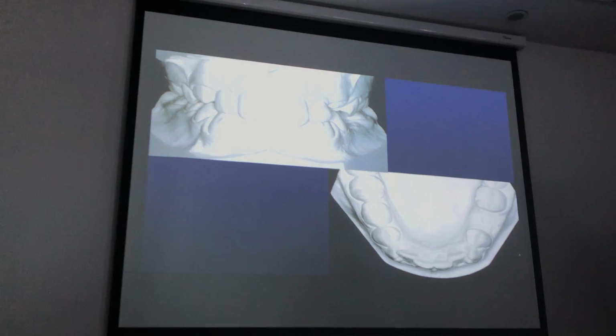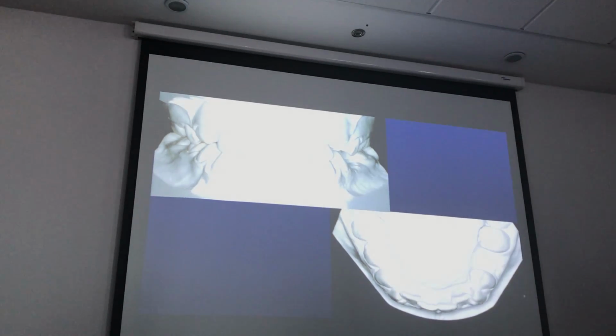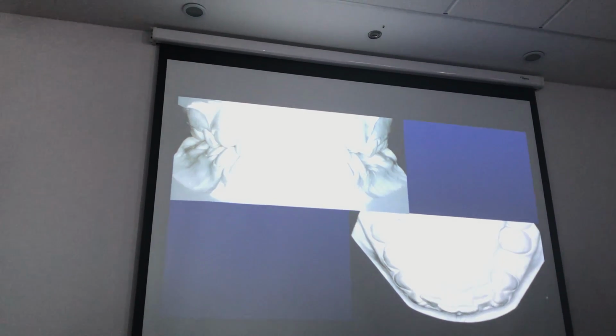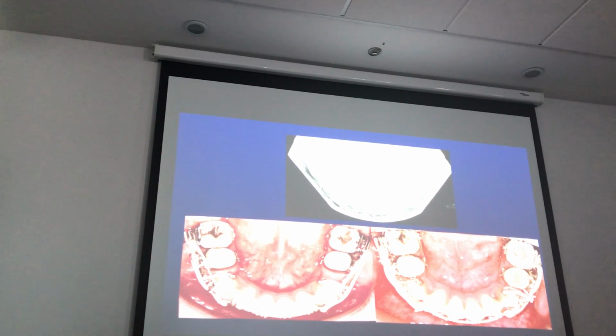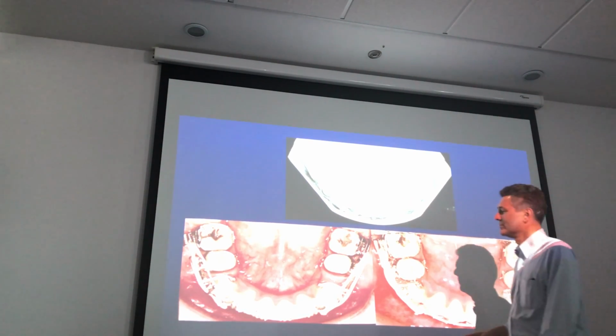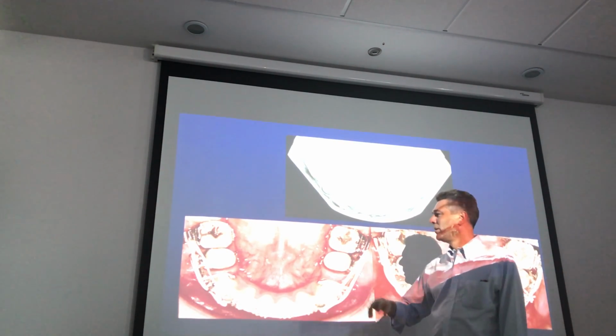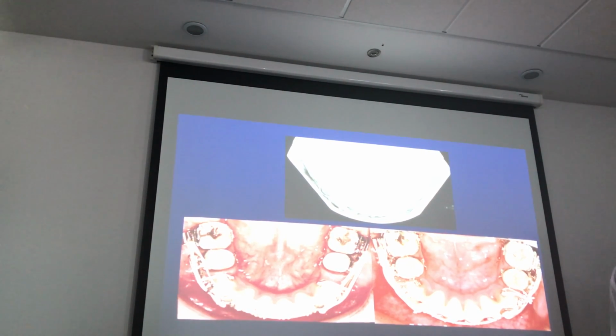Put a lingual arch. The bumper in the arch. Okay, now, you decide what you want to do. One side is a class 1, one side is class 2, so there is a protraction on one side.